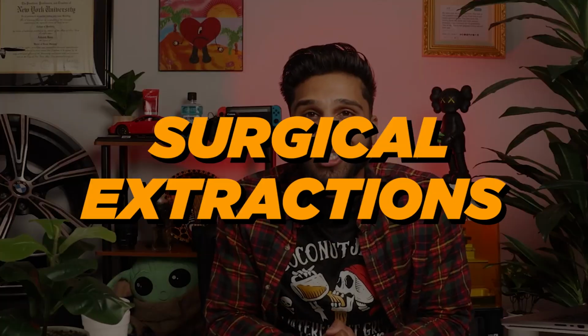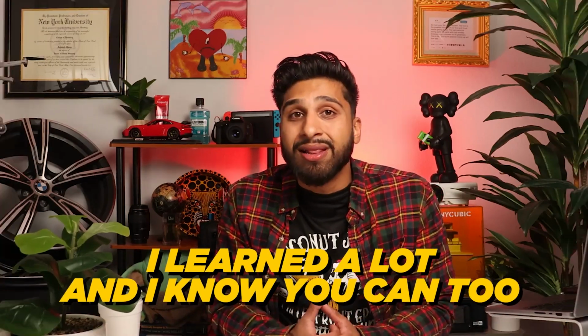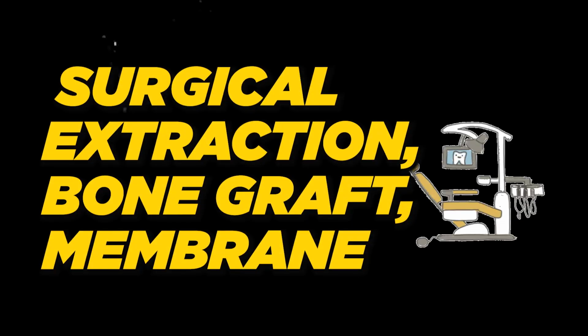Let's talk surgical extractions, bone graft, implants, everything oral surgery. I'm super excited to show you this case because I learned a lot and I know you can too. All right, let's cut the intro short. I got a patient that presented with a tooth with a periapical radiolucency. Treatment plan was surgical extraction, bone graft, membrane, and future implant placement.